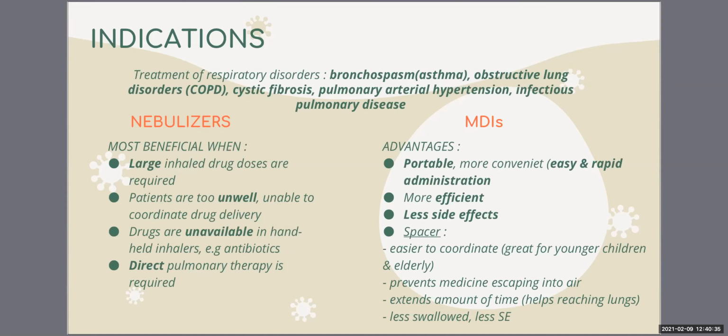And other than that, this spacer will hold the medication from the MDI to waste less, meaning it will prevent the medicine from escaping into the air. And it also extends the amount of time for reaching the lungs. As compared to when you use MDI alone, there is a high chance of the medication being left at the back of the throat. And when this happens, the medication will be swallowed and cause side effects.